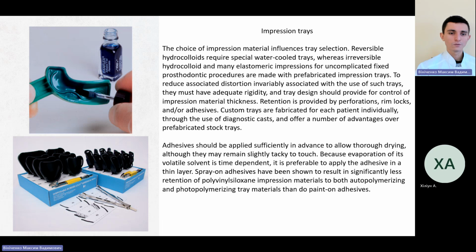Custom trays are fabricated for each patient individually through the use of diagnostic casts and offer a number of advantages over prefabricated stock trays. Adhesives should be applied sufficiently in advance to allow thorough drying, although they may remain slightly tacky to touch.